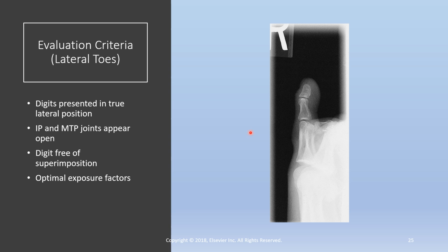Yes, I would definitely have gloves on to image the feet. Not because I think everybody's feet are dirty, but typically feet are sweaty. They're probably at times going to be bloody, sandy, you name it. They're just going to have something on them. So wearing gloves is likely to happen when we are doing toes and feet.